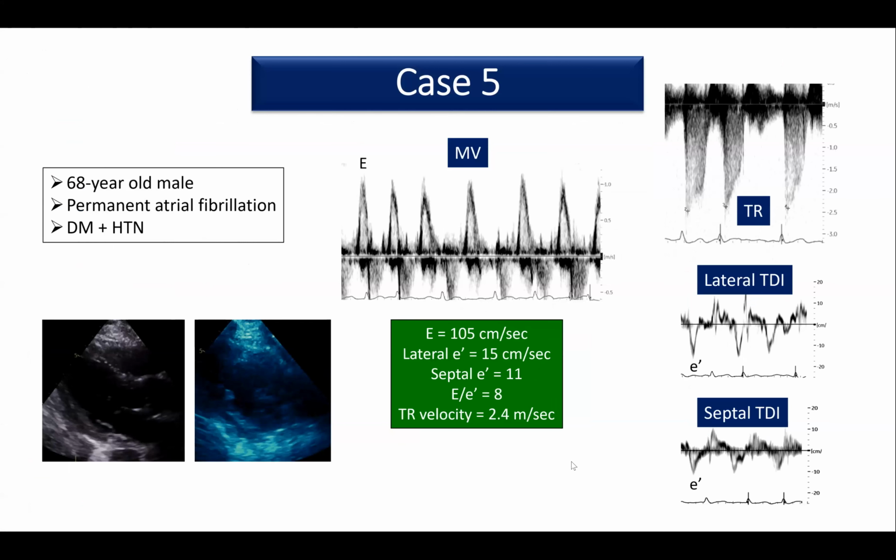Yes, now clear. Okay, so again, this patient has a very good ejection fraction. You can see here at the transmitral Doppler, you obviously can see E waves, but no A waves. And what typically happens in atrial fibrillation is that the E wave velocity tends to go up, and the deceleration time tends to go down. Even the filling pressure can be normal.